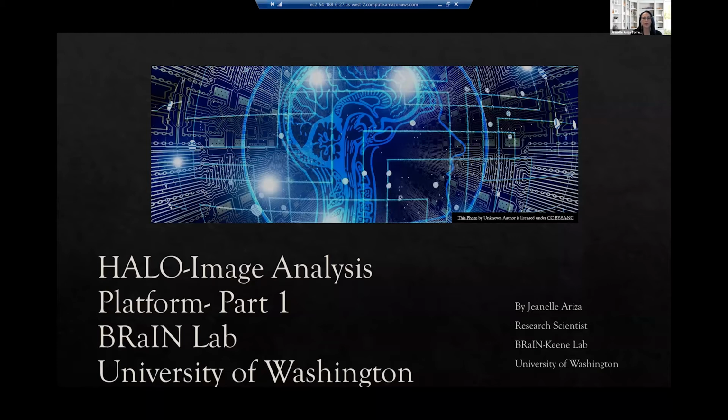Yeah. Okay. So my experience in image analysis is a little bit wide throughout the whole several years of investigation, but recently it's been focused on the whole slide image analysis using Halo image analysis platform.